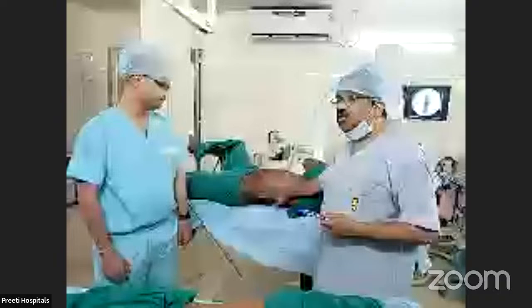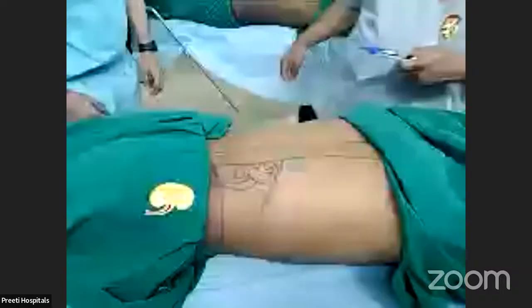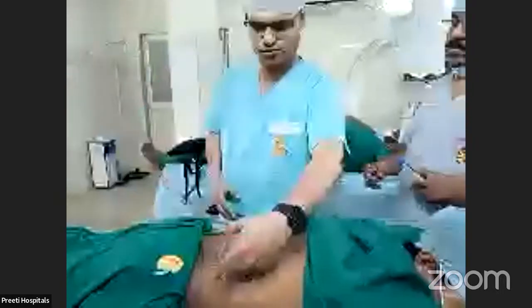Now the upper pole, for example a supracostal region, where the upper calyx is like this. Here also it is supracostal. How will you approach? Coming to prone PCNL for a single superior calyceal stone, we have to see, especially in left-sided kidneys, whether it may come above the 11th rib. Then we have to come a little to the periphery and do a peripheral intercostal puncture. We can clear the stone, it will be a vertical puncture.